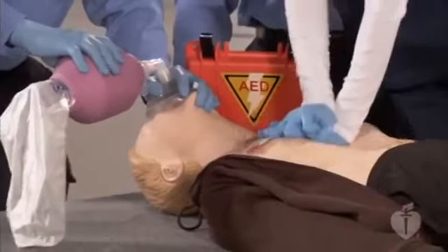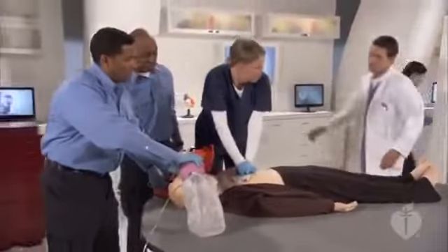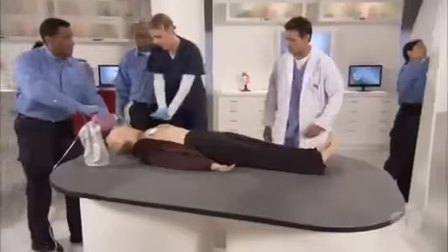The case progresses with the arrival of a team of advanced healthcare providers. Okay, what have we got? The patient, 18, suddenly collapsed during a meeting. We started CPR immediately, and we've shocked the patient once, 1 minute 48 seconds ago, followed by immediate CPR. We've got the ECG monitor attached now. It's now 2 minutes from our last shock.